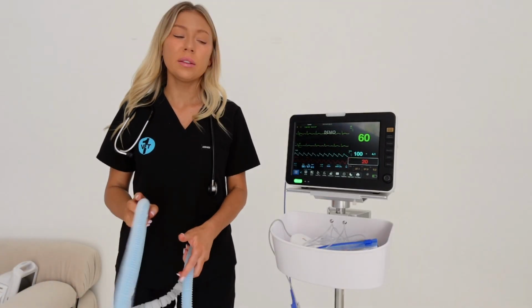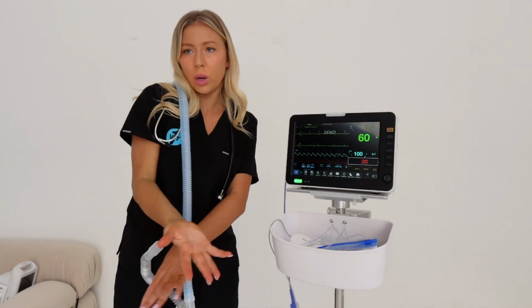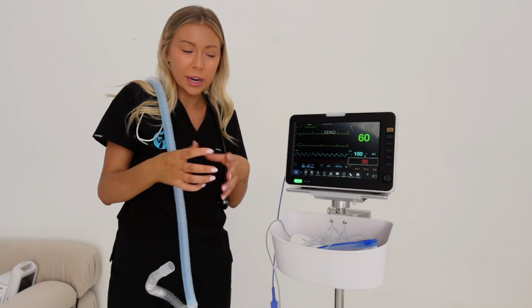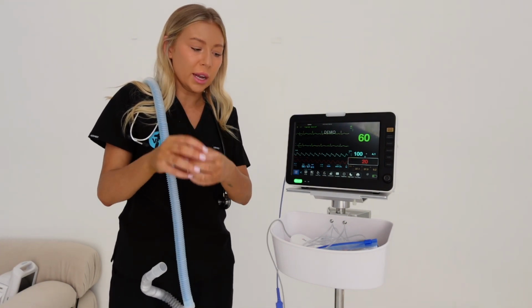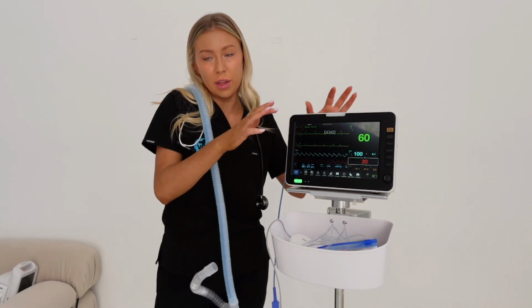And last but not least, it's really important that you are placing your monitoring equipment higher than your patient. Especially with the respiration and things like that, you don't want any fluid in the lines tracking back up to your monitoring equipment. So this needs to be elevated a little bit higher than your patient.